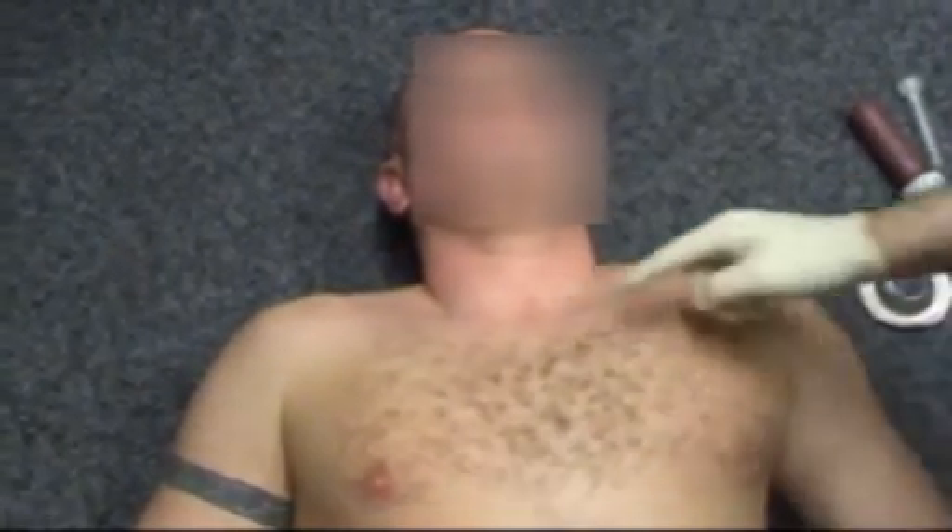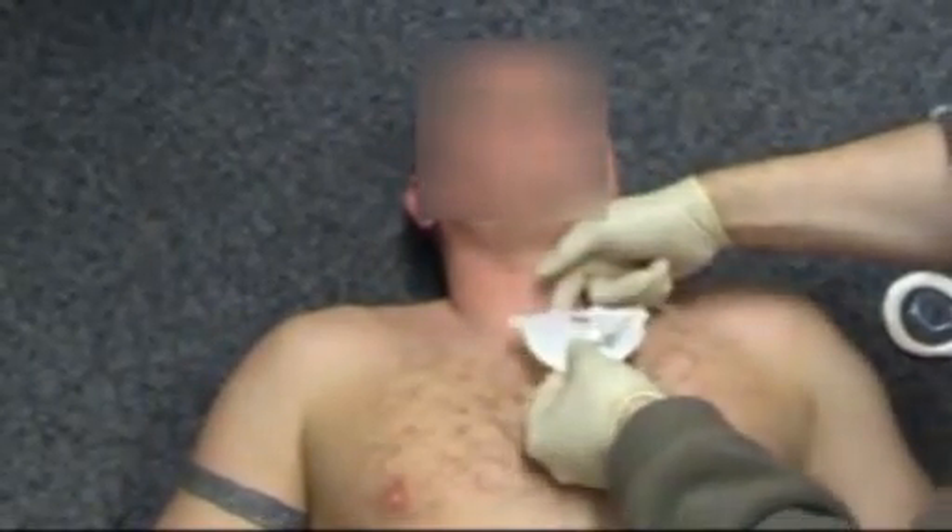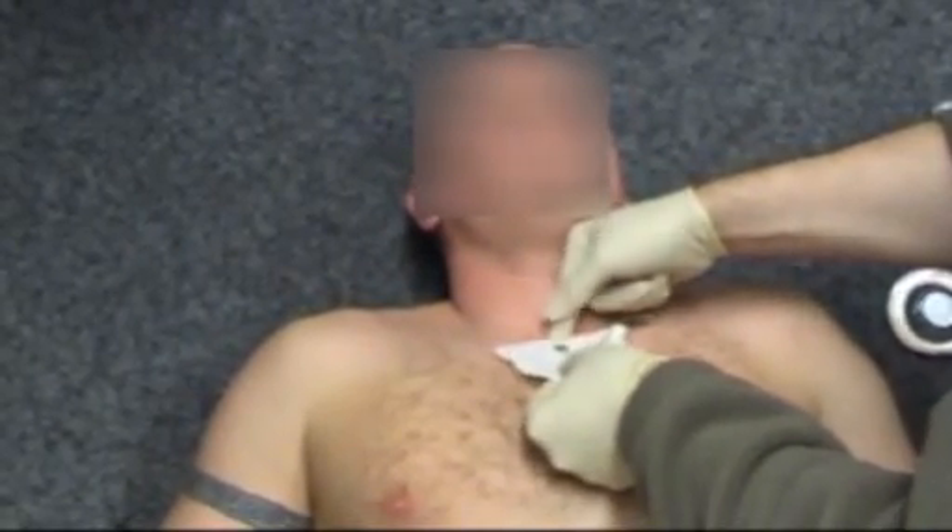So, aseptic technique. The site's clean. Do you want to raise it? There you are. Now, patch. Nice. Using two parts. So what I'll do is put my finger right into the notch. Place that up to me.